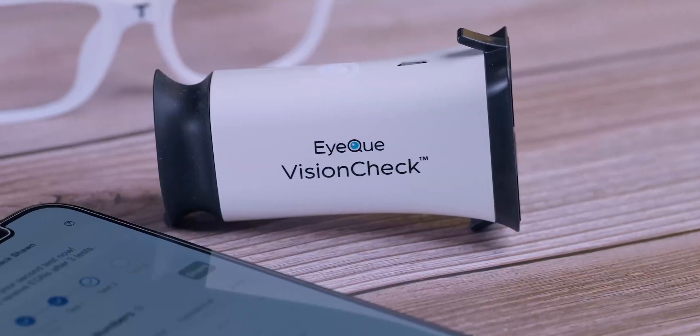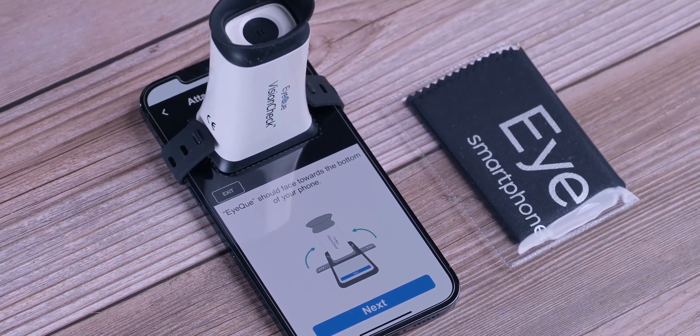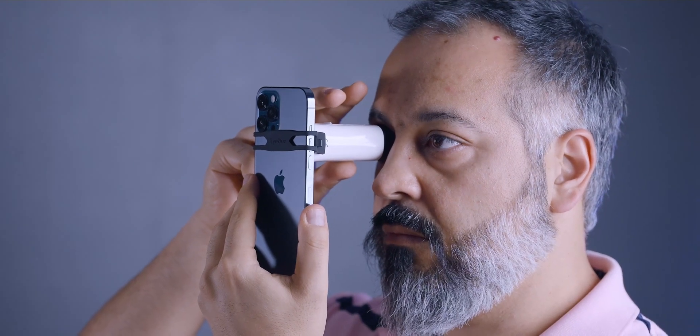In a nutshell, you get to check your eyeglass numbers to see if they have changed, or if you need to change your glasses, or if you need glasses at all — all at home without going to the doctor. So this is their main product, Vision Check. This is the actual device you use to measure your eyeglass numbers.